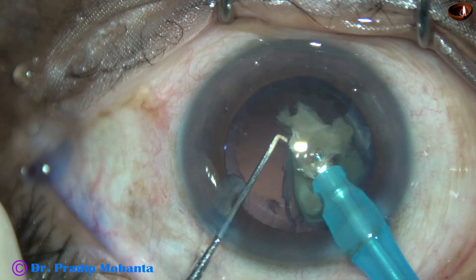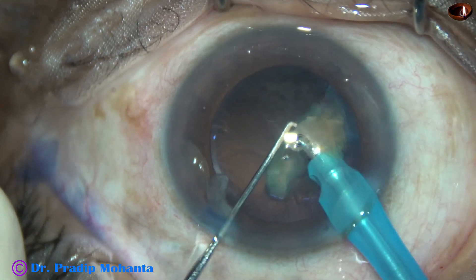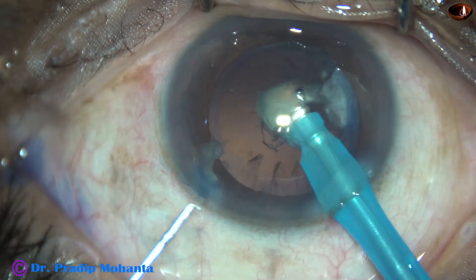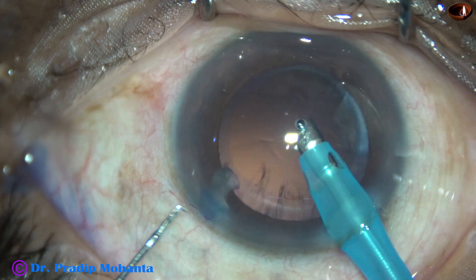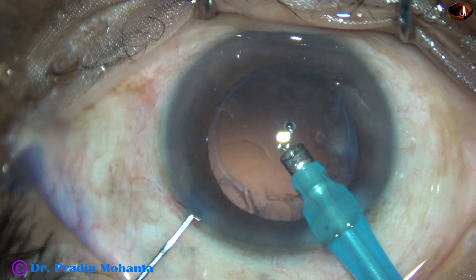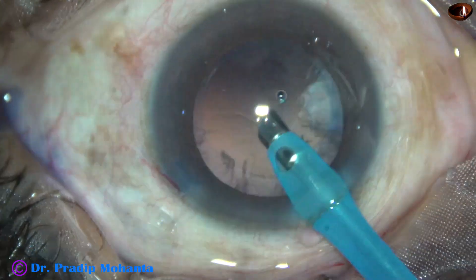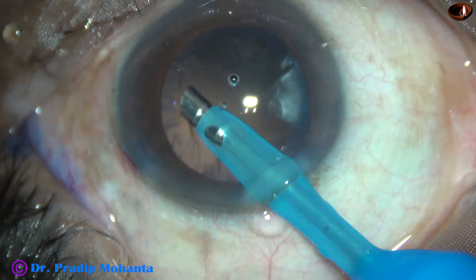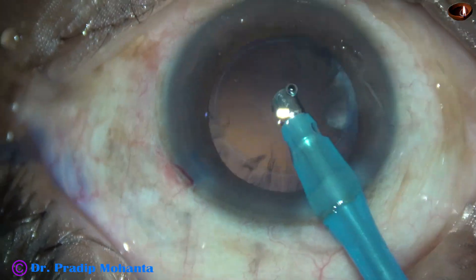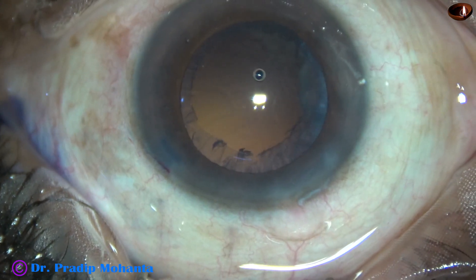At this time we can decrease the parameters. Phaco power from the beginning was about 75%, flow rate was 45 ml per minute, and vacuum was 450 mmHg. I tried to remove a portion of the cortex by the phaco needle itself, but found it was dangerous and came out.